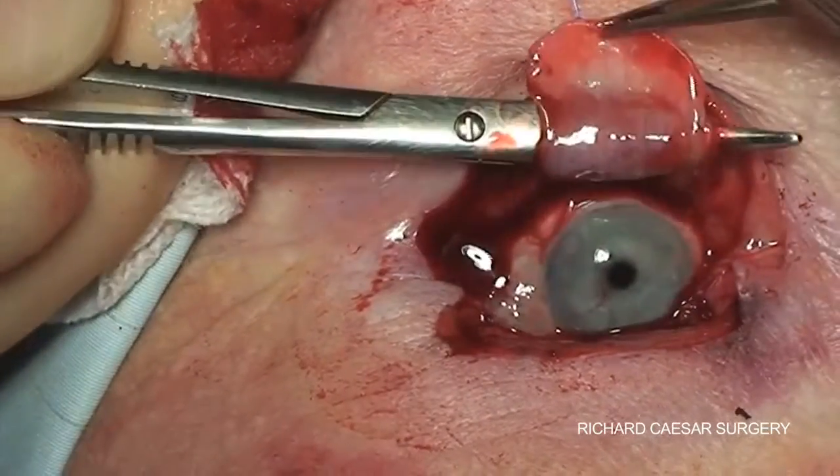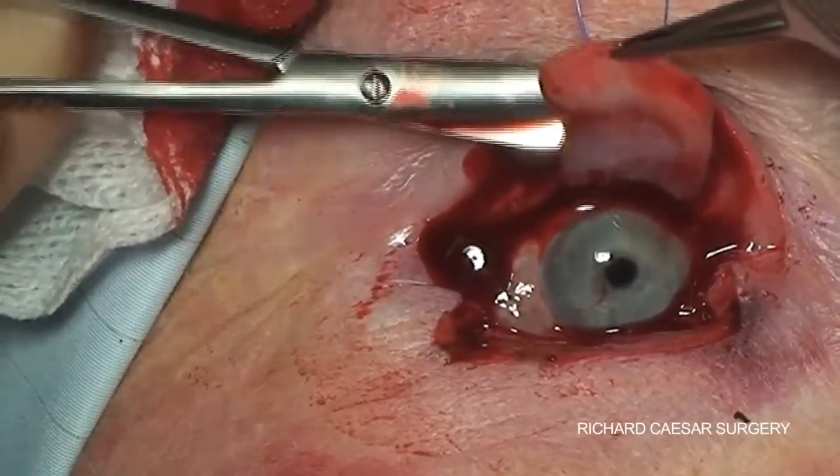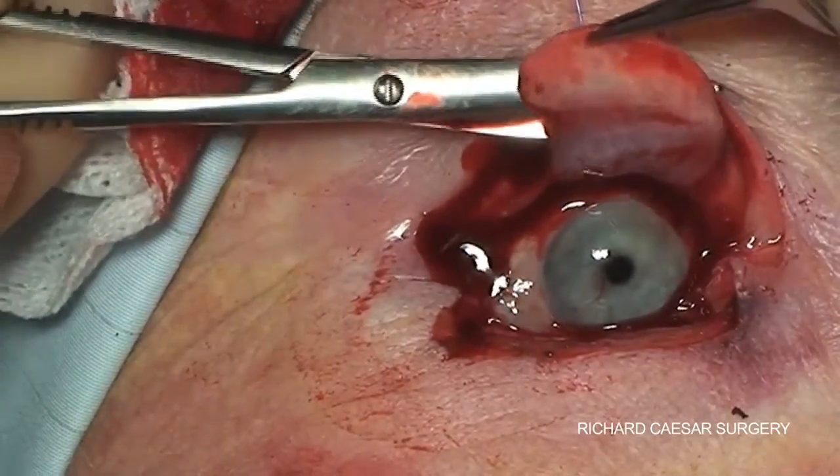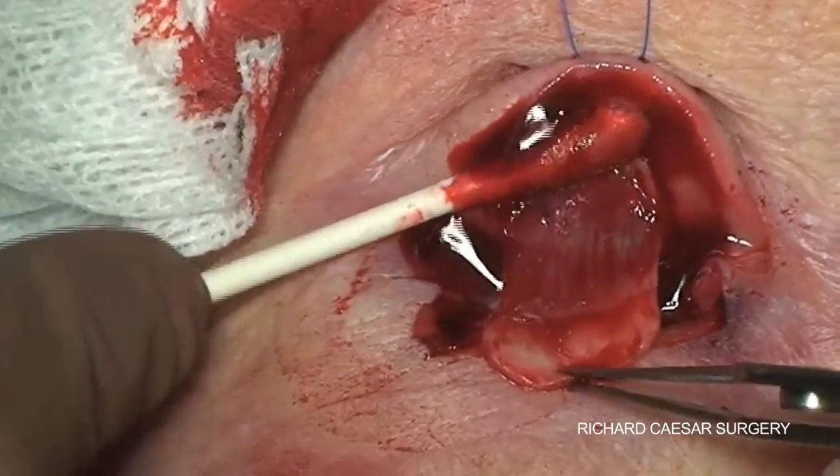Taking Müller's muscle off is then as easy as leaving one arm of the scissors in that tunnel and the other on the outside. And there you go — one nice Hughes flap.